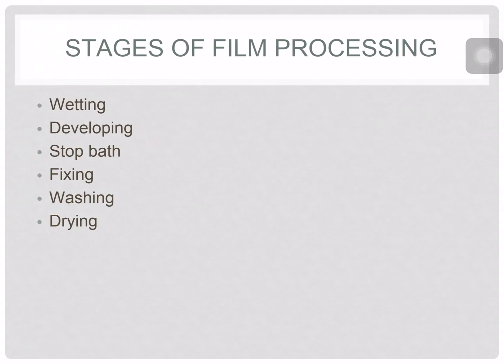And yung chemical na yon, sasabihin ko sa inyo on the later part of this video. So, kailangan ng adequate washing para maiwasan si hyporetention artifact. So, after washing the film, it is ready for drying. Okay? So, drying, after nun, it is ready to be read by our radiologist.